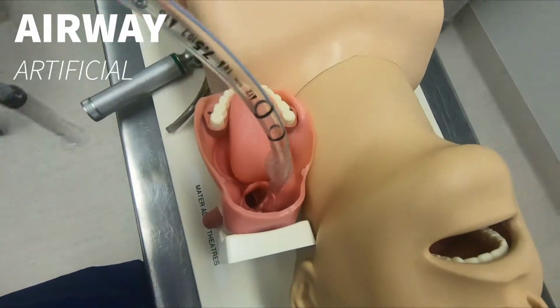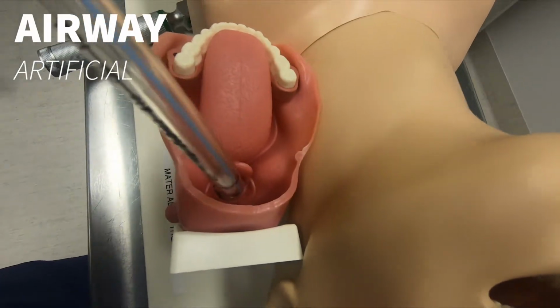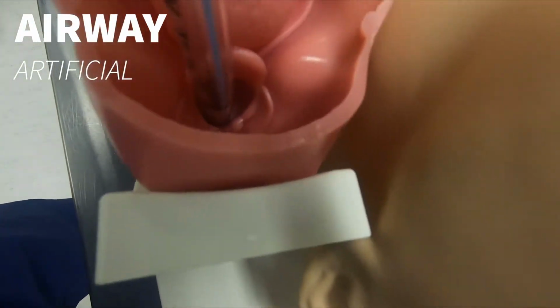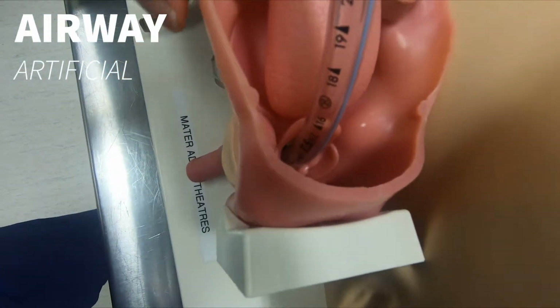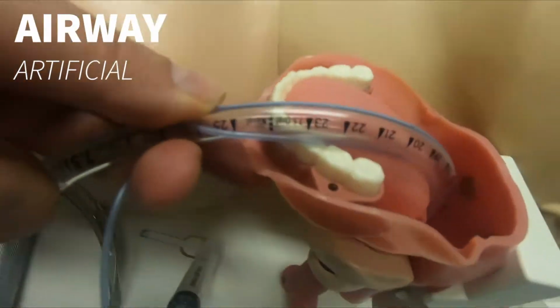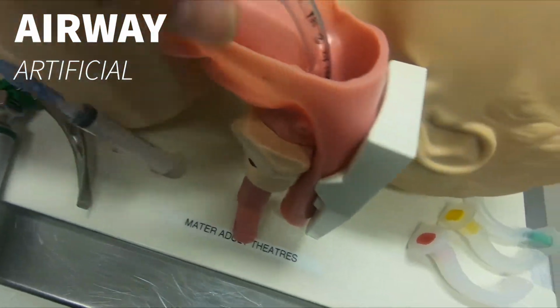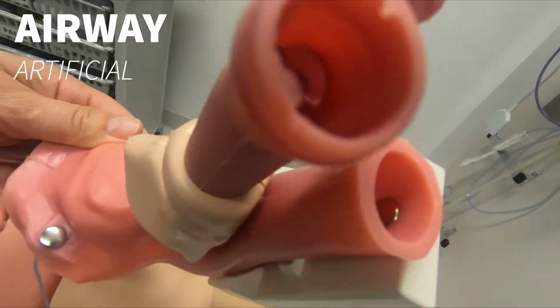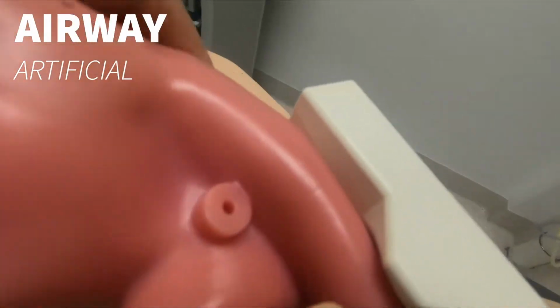Usually coming from the side so you don't occlude your vision. There's my two black markers. You have to see this for yourself, and we'll go in and make sure we're not going too far. So this one I've intentionally put very far. It's 25 at the lips. Now, why is that too far? If we look at the bronchus here, you see it has gone into the right bronchus. So it needs to come back a little bit.